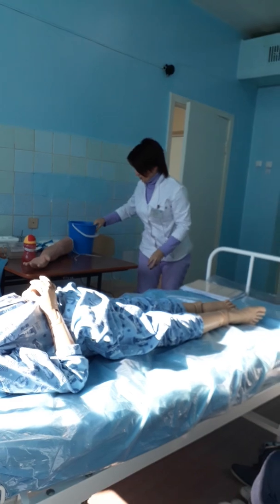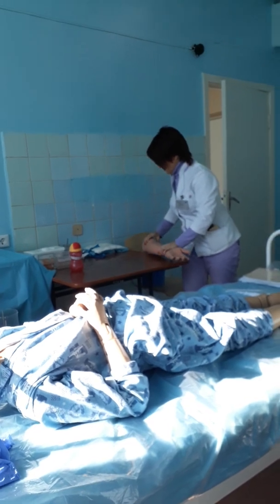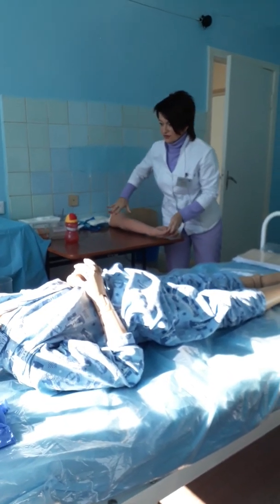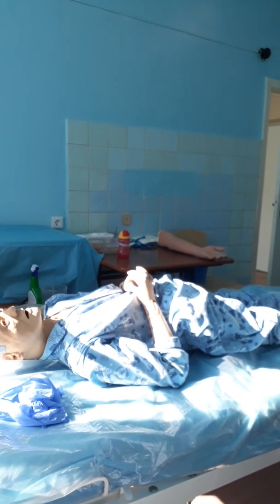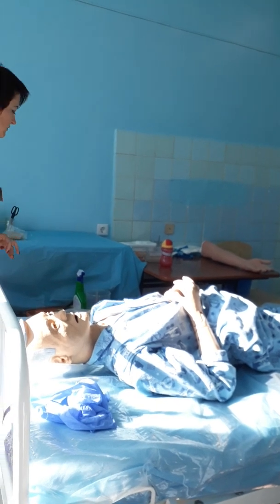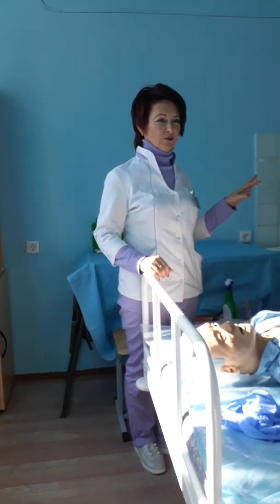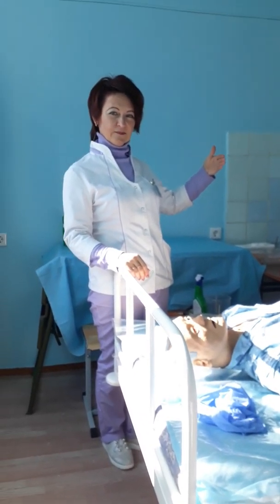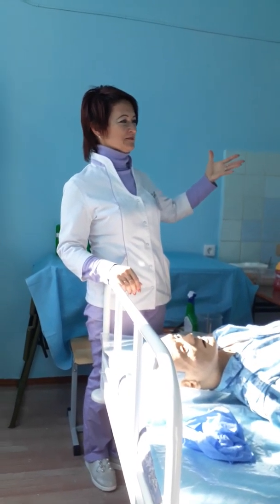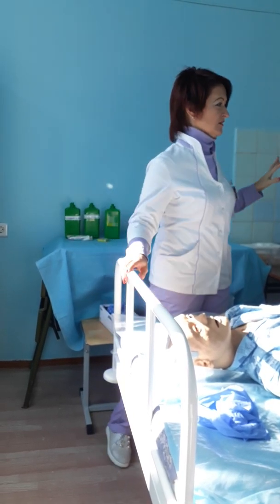For this manipulation, every time you first check your medical equipment and items on your working place. Prepare your manipulation table and a table for disinfection and other parts, and afterwards you start your real working practice. Repeat, please. Every time it's the same algorithm.